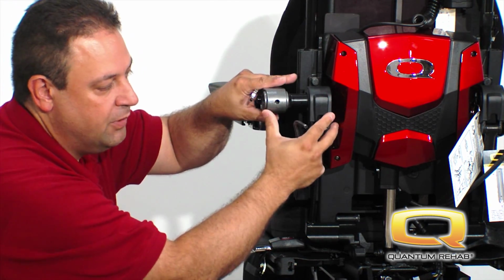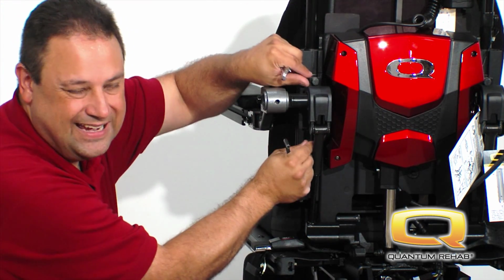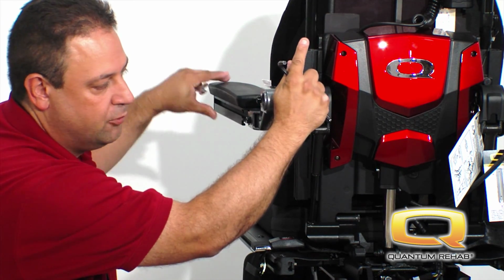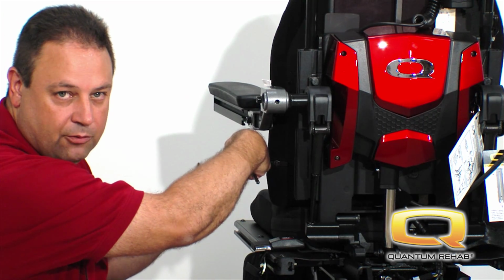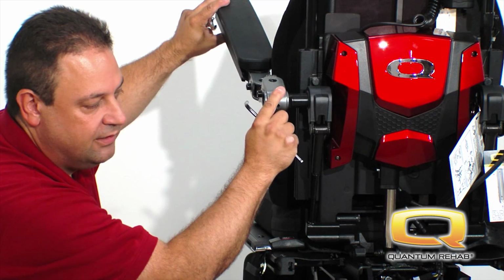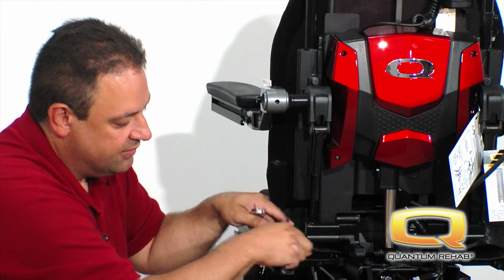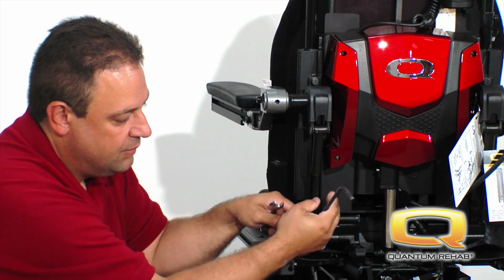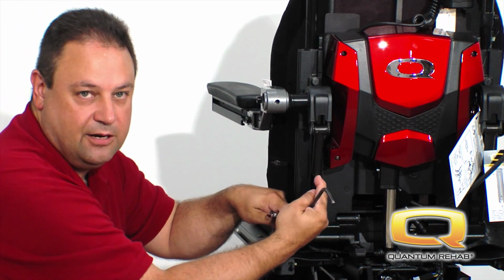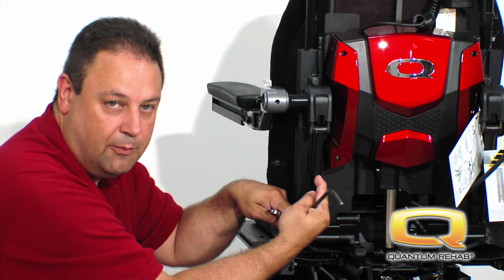You're then going to take your pillow block and slide your arm up or down as needed to fit the patient. Tighten it down. At that point, depending on if you move the pillow block in the upward direction, your arm will be angling down. If you push your pillow block downward for the patient, then your arm will be tilted in the upward direction. So then, to get your arm re-leveled, you now take your Allen key, put it on the head of the bolt, spin your turnbuckle to re-level out your arm, and then tighten up your bolts here on the turnbuckle. And that's how you achieve arm height adjustment.